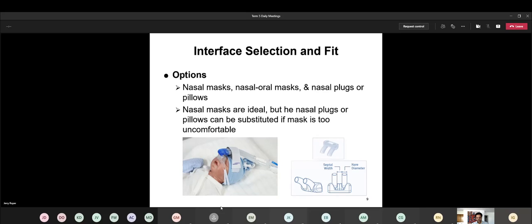And what we used to do is we used to alternate. Each time we went to assess the baby, we had to switch out like so many hours on the nasal mask and then so many hours with the nasal prongs. And the only reason was because those prongs can over time cause a lot of skin breakdown. And the masks will kind of help to avoid that, but the masks are not very, what's the word I want to use here? They leak a lot.